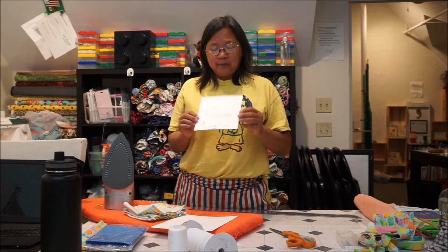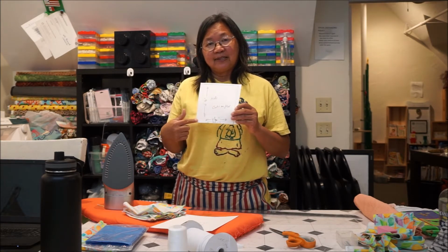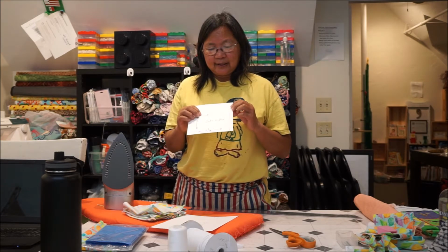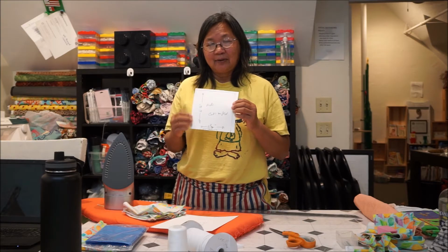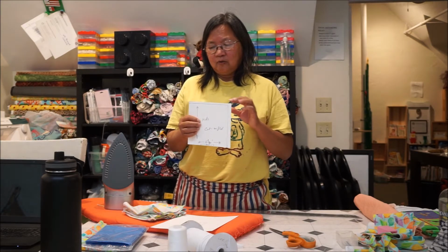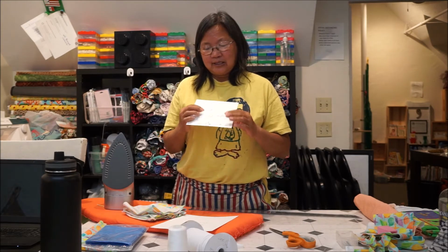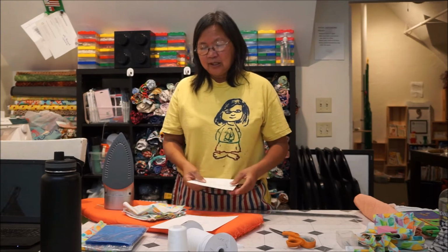I made a pattern. This is a kid's mask. A kid's mask is 6 inches by 6 inches, and then I added a 1/2 inch for a 1/4 inch seam allowance on either side and a 1/4 inch at the top for the seam allowance. And then you're going to put this on the fold of the fabric and cut it.